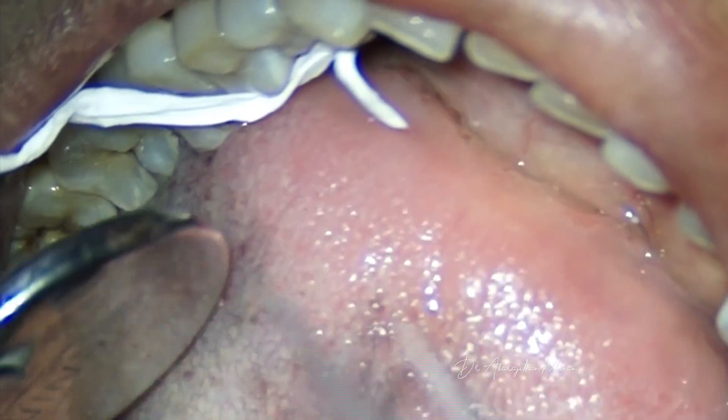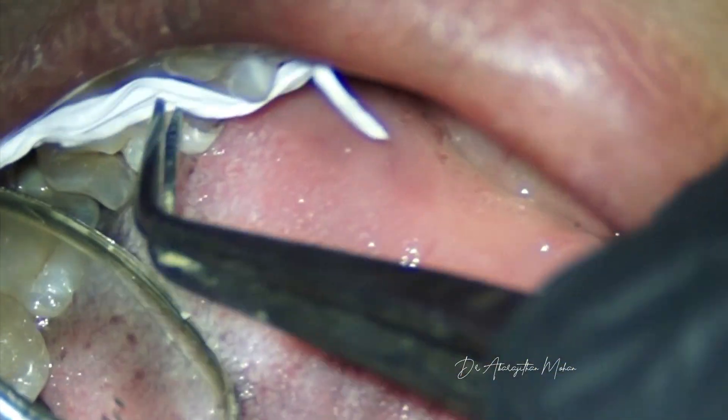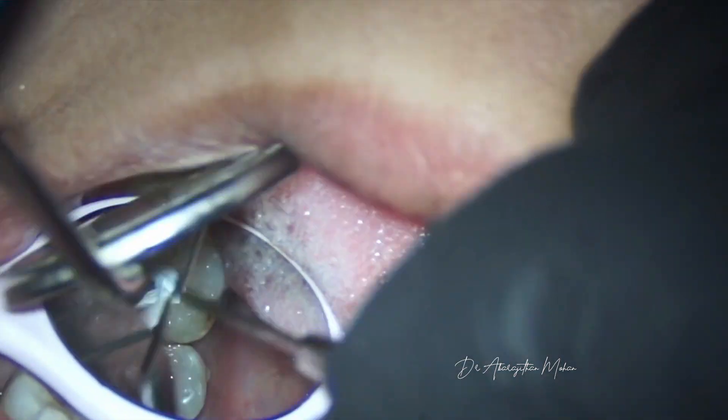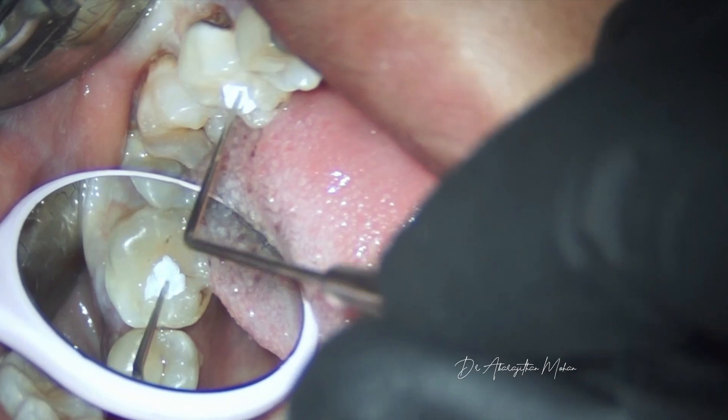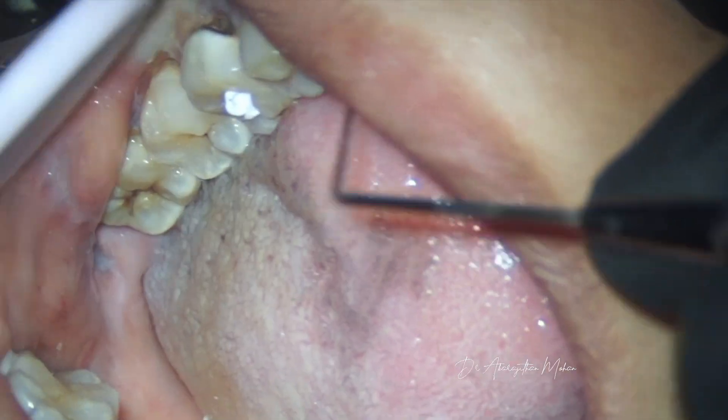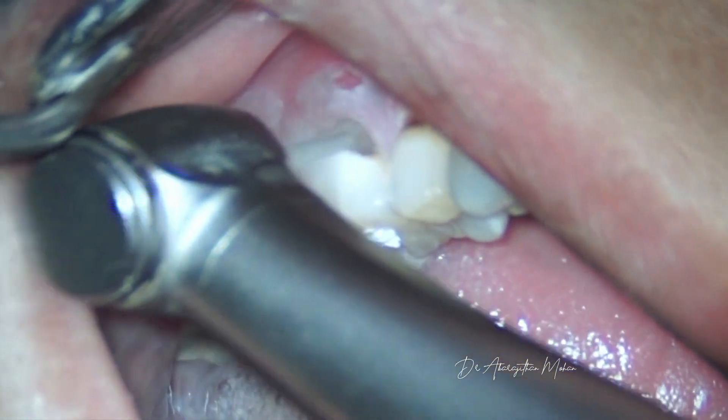After this initial access is done and upon tentative location of the canals, we block the pulp chamber and the orifices with Teflon packed nicely into the pulp chamber to protect the orifices from getting blocked during restoration of the proximal cavity.